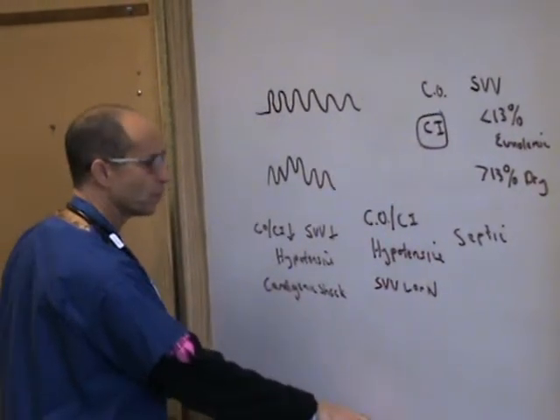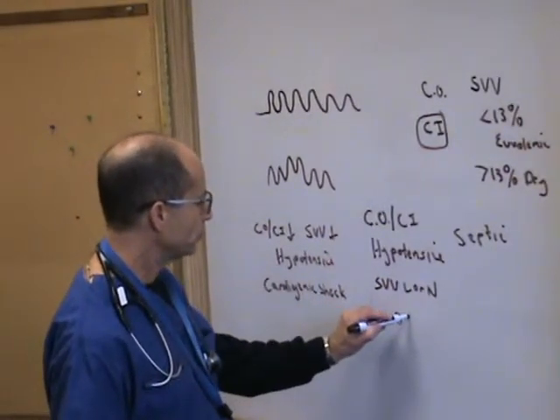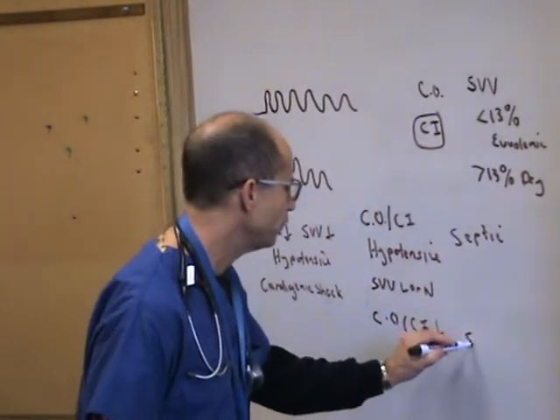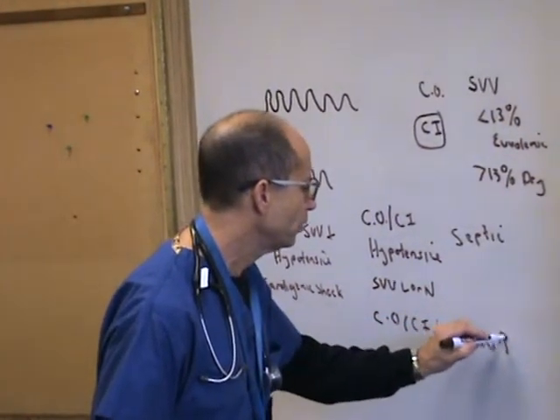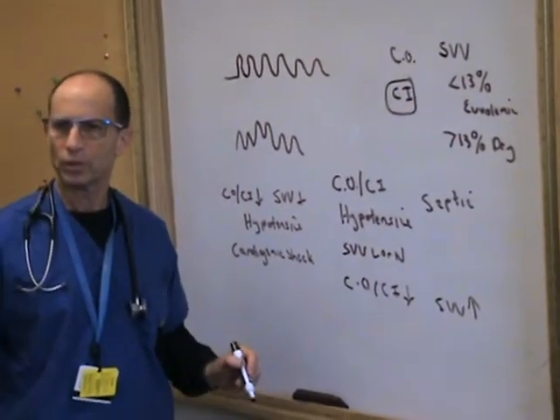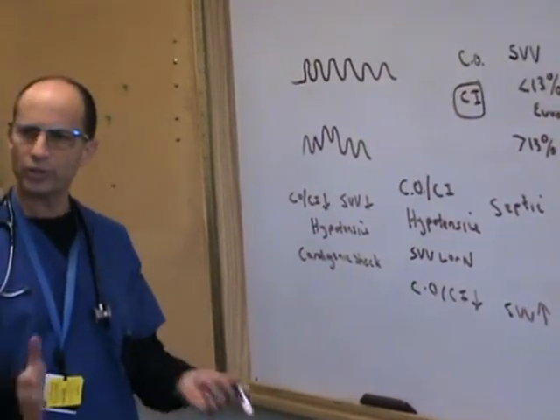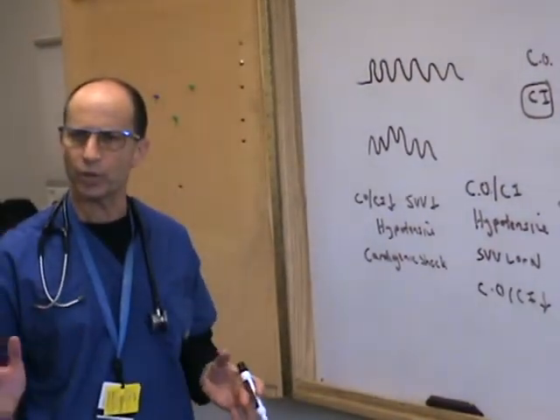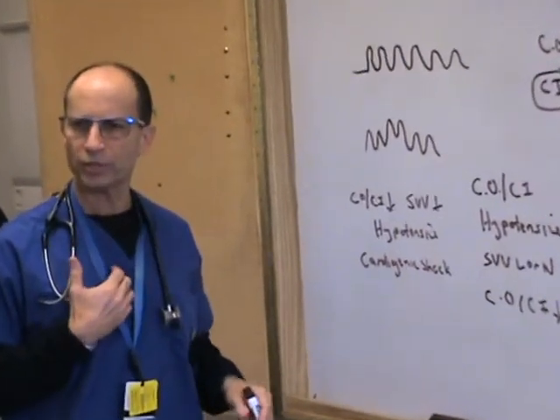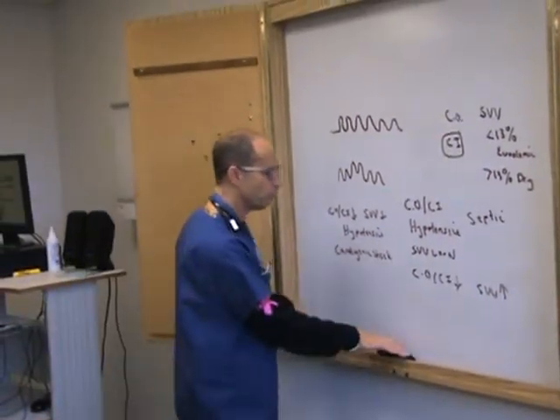And then if you have low cardiac output or index, high SVV, and a low blood pressure, they're hypovolemic. So it's pretty much the same hemodynamic profiles. And we've actually had both of these in people, and they correlate pretty well. The people they're most difficult to correlate in are probably people with pulmonary hypertension, because it's a different animal. But still, they correlate pretty well.